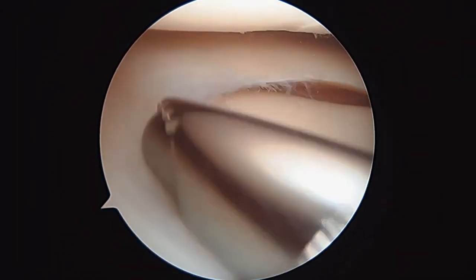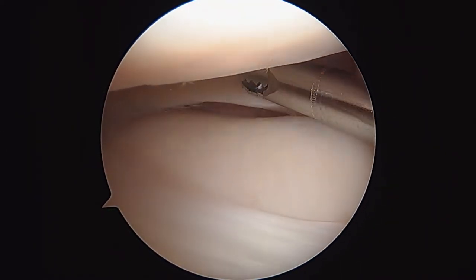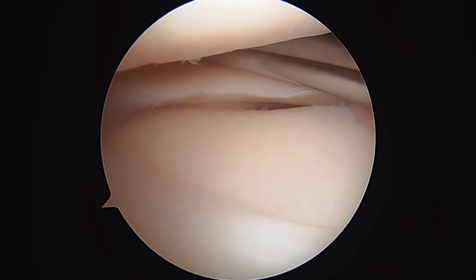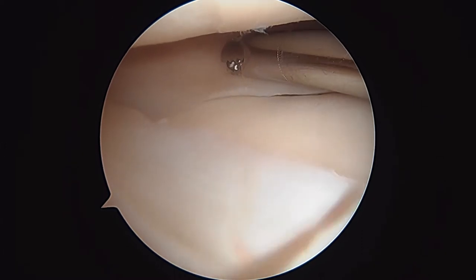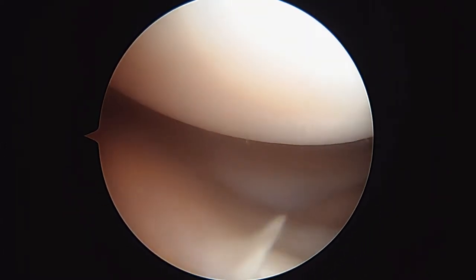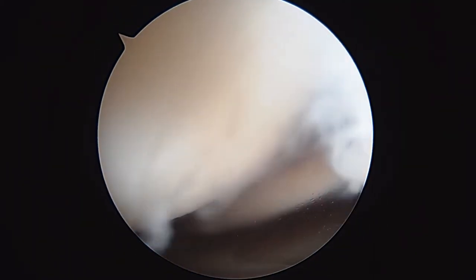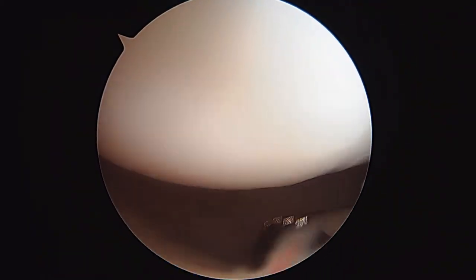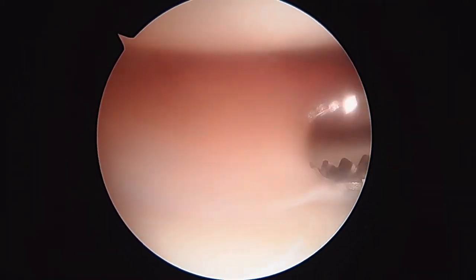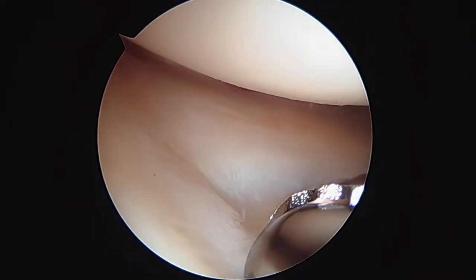I just want to check the articular surfaces. The tibial plateau looks good on the lateral side. I'm going to pull back and look at the articular surface of the lateral femoral condyle — every place I can see it here, it actually looks pretty good. So I think this is going to turn out to be good news — you had just a little flap tear.